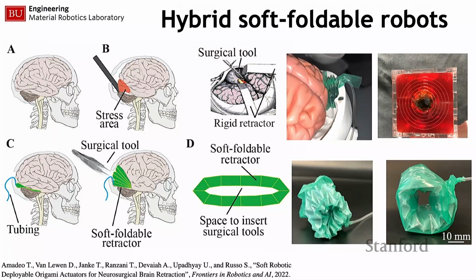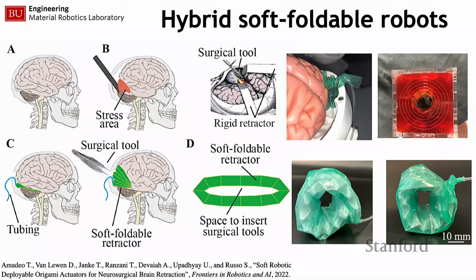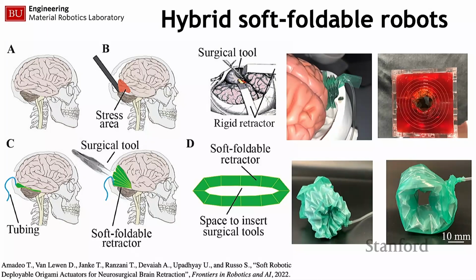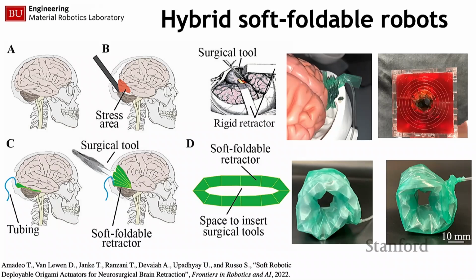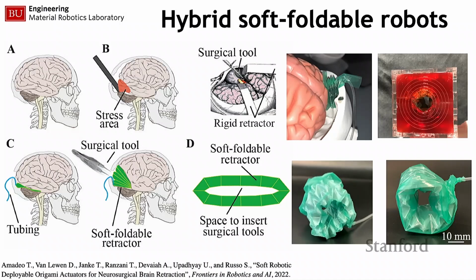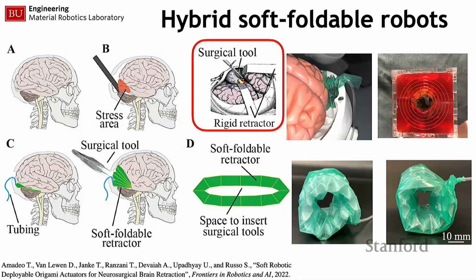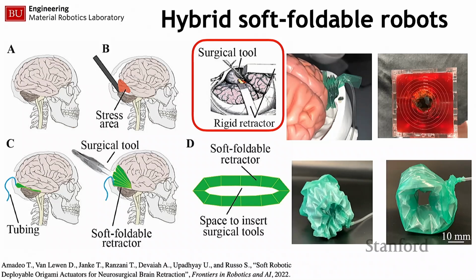And I was approached by a neurosurgeon when I moved to BU who was very excited about this technology and told me, oh, can we do something for neurosurgical procedures on a daily basis? I'm trying to access tumors located in a very deep position within the brain, and like I mentioned, they can reach that tumor, but then postoperatively they have complications for the patient, right? And the reason why they have these complications is that they're using stainless steel spatulas that are pretty rigid, and they have no sensing, of course, embedded onto them.